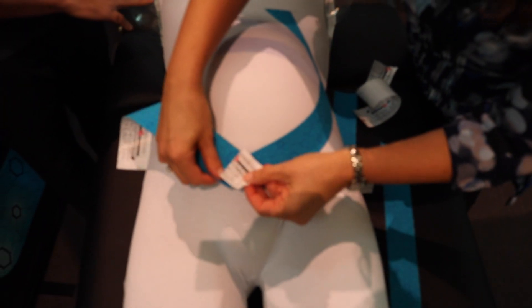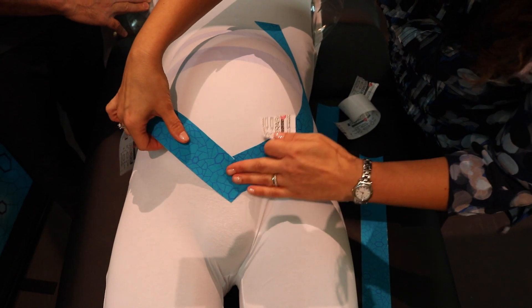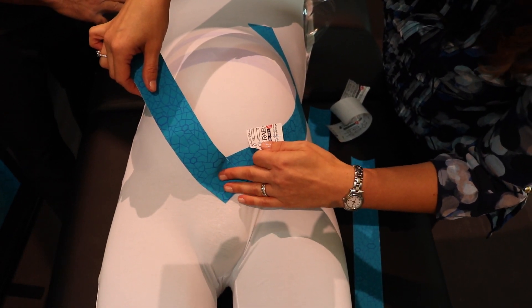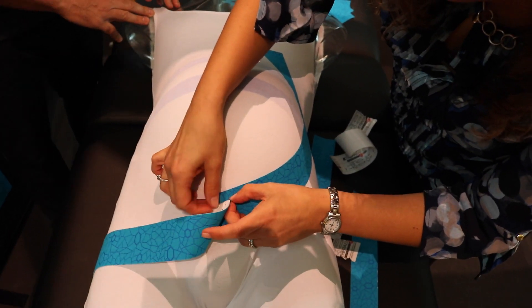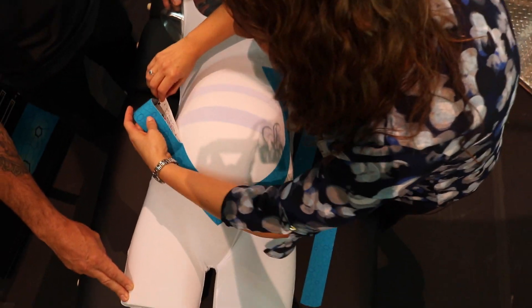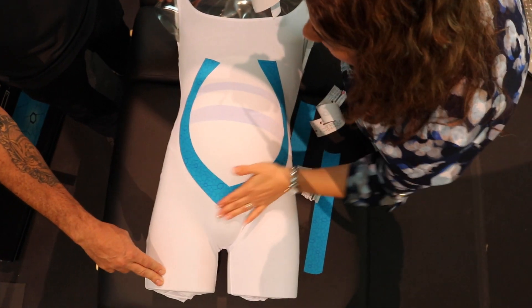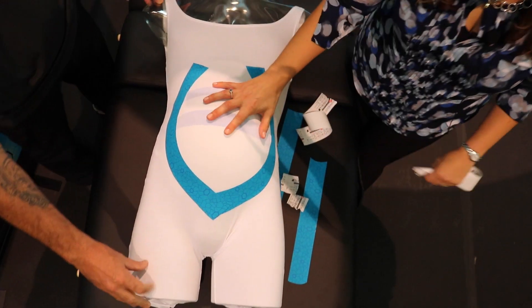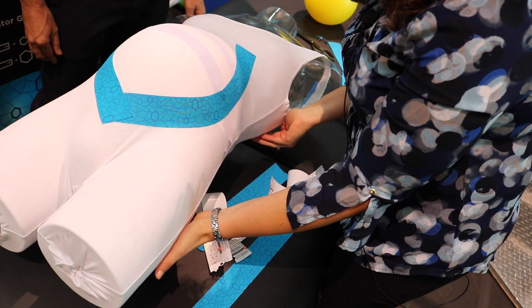Again, I lay it down to tape tension, making sure we have the component over that pubic symphysis, allowing mom to go ahead and activate the tape for me so I'm not getting too close. One critical consideration: we don't want mom laying on her back for long, because as the fetus matures, lying supine can decrease blood flow to the fetus. So if you're taping with mom on her back, go ahead and place a pillow or wedge to prop her up.